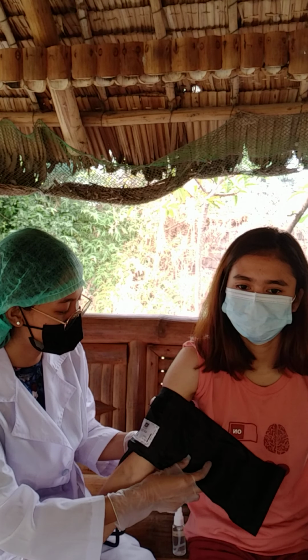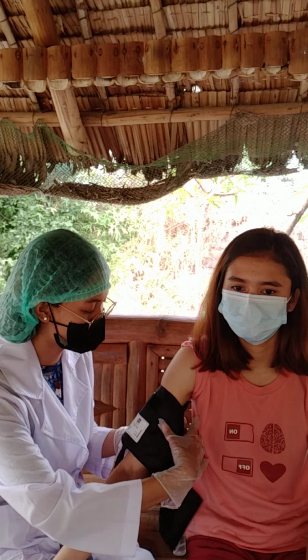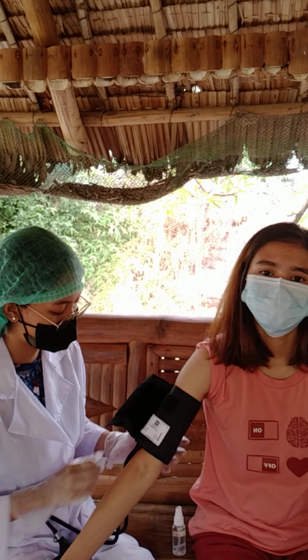Dapat hindi masyadong mahigpit. Dapat normal ay sakto lang yung pagkakaraap sa kanya.